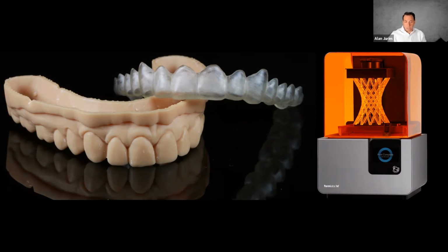Once we were able to produce them digitally, we began manufacturing them with a milling machine first. And then we were fortunate enough to have the development of the materials that meant that we can then 3D print them. And I'll tell you now, digitally printed bite splints and night guards is probably the most common thing that we are printing in the office. I should say the most frequent.